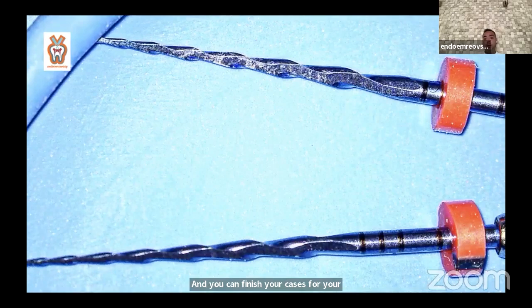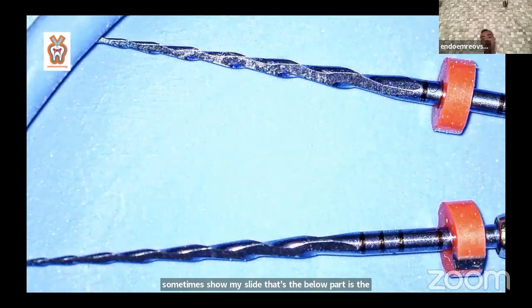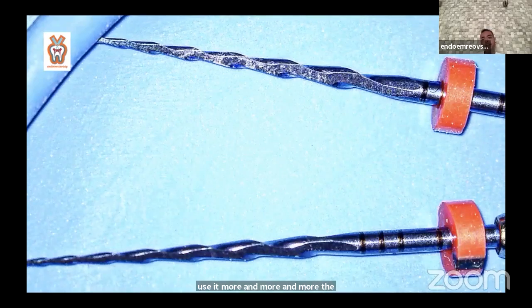So I sometimes show my slide, where the below part is the new F1 and the upper part is the used F1. Of course you can use F1 more than once, but if you use it more and more and more, the file tears easily and it prevents you from having the apical stop. This is basically the most important point for using endo files.